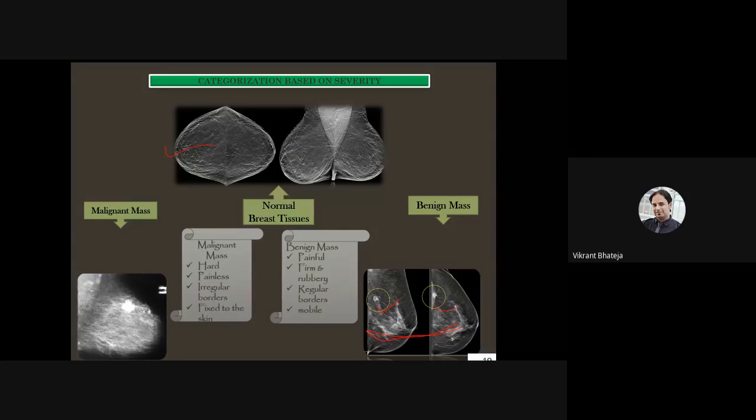Both these marked regions have a nearly balanced periphery. As I told you, once the periphery of the tumor is very balanced, very regular, very circumscribed, it is not a very dangerous kind of tumor. Currently it is in the inactive stage, that is, metastasis has not started affecting the nearby cells. You term this a benign mass.